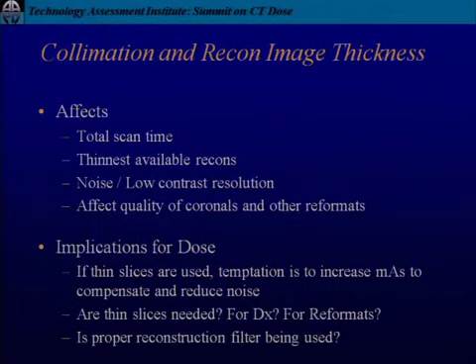Tony, I think that's exactly right. I didn't make that point maybe as clear as I could have. As a medical physicist, I can expound on exactly those principles when I sit with my radiologist and with my techs. And the question I ask my radiologist is, what do you need? What are you looking for? I hope you'll stand up and ask that question when our more clinical colleagues, our radiologists, come up and talk about their protocols and say, what do you need to see?